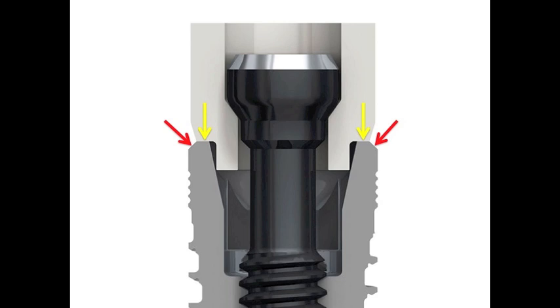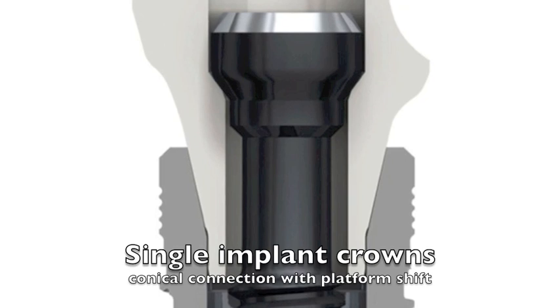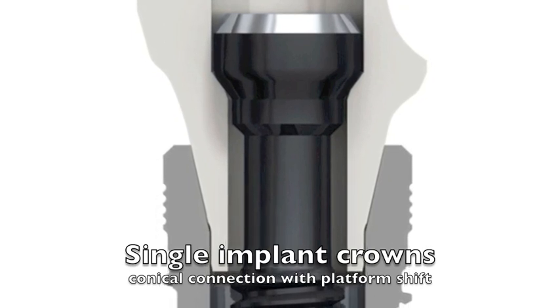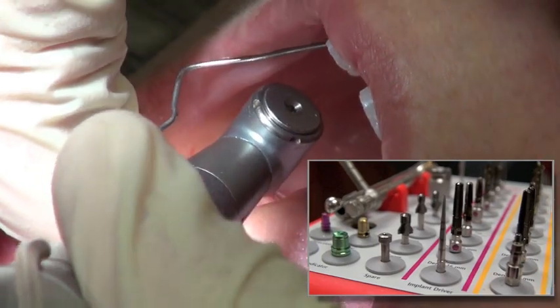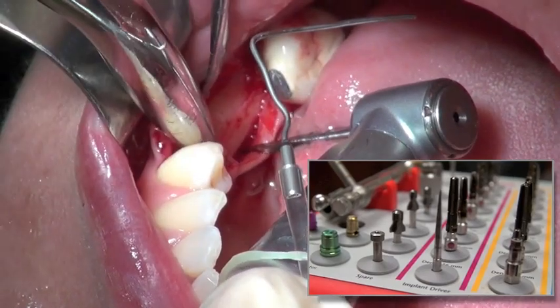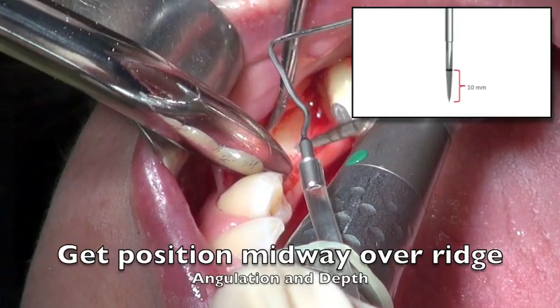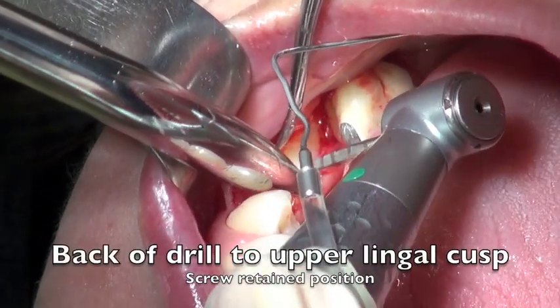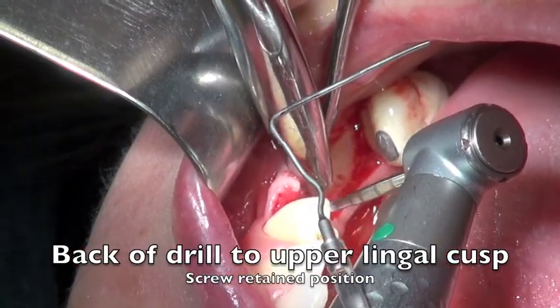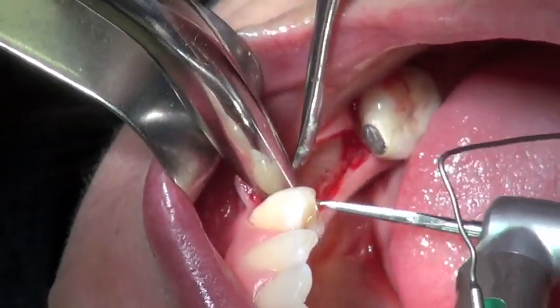This is a great design. If I chose to do singles, I can use a platform shift on both implants and make this either a cement retained bridge or singles. In this case we're using a lab fabricated guide just to mark the ridge for where we're going to place the implants. I use a precision drill and feel the lingual and buccal, split the distance once I've marked it, then go in a few millimeters keeping the back of the handpiece pointed towards the lingual cusp of the upper teeth to keep this in a screw retained position.